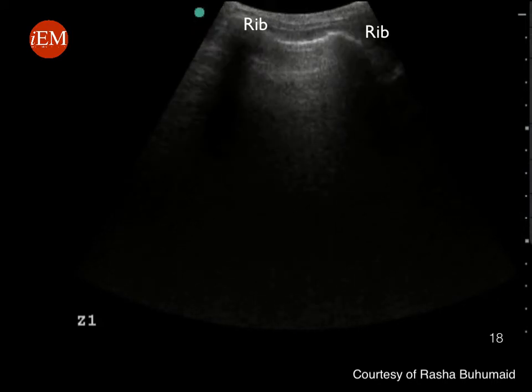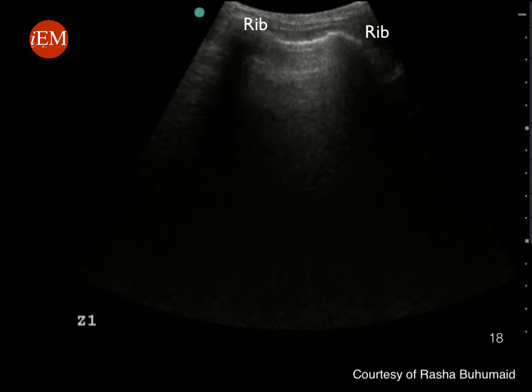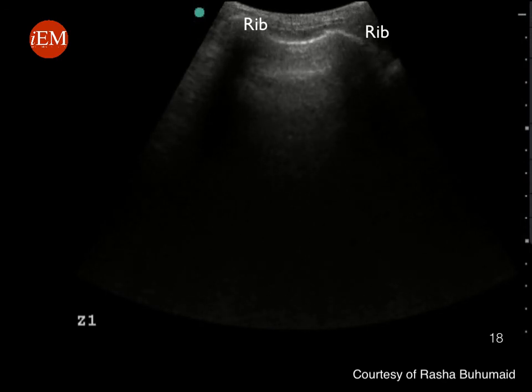Note the A-lines, which are normal reverberation artifact from the pleural line. This is a normally aerated lung with no evidence of pulmonary edema.